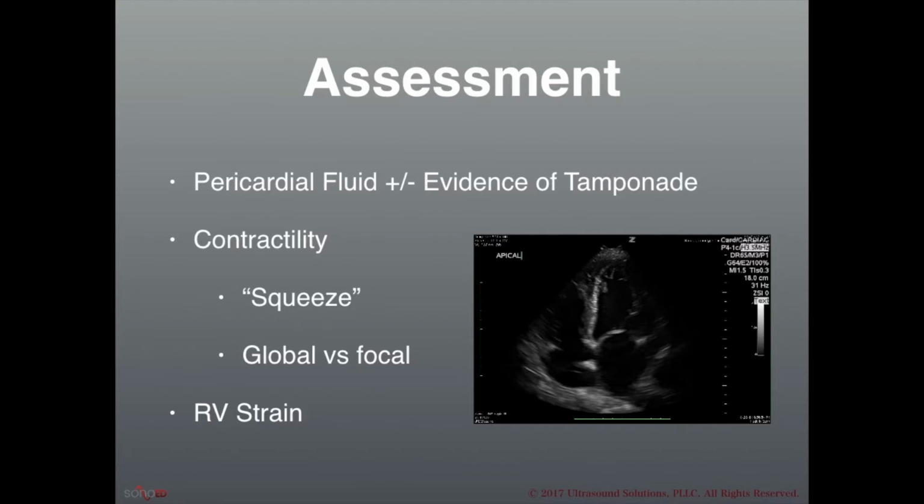And if you really stick to assessing those three items within the purview of emergency medicine and point-of-care ultrasound, you will definitely stay well within the standard of care. There are many advanced topics that cardiac ultrasound can get into, but I would say that those are the three that are really normative and within the standard practice for emergency physicians.